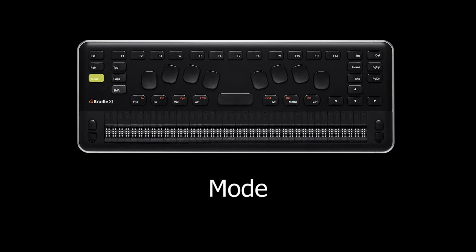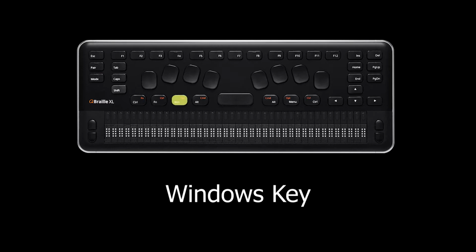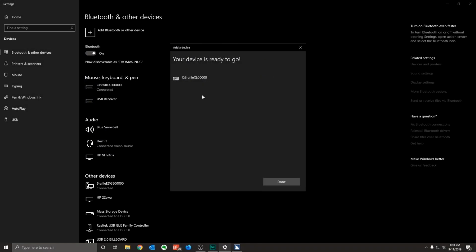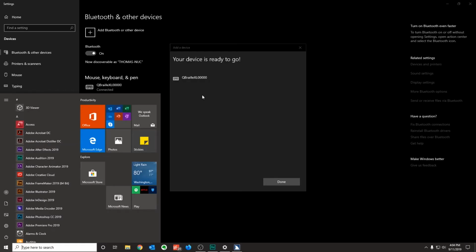To do this, I'll just hit the Mode button on the QBraille, and I'll get a Braille notification that hybrid mode has been turned on. I could test if hybrid mode is turned on by hitting the Windows key on my QBraille, and if the Start menu pops up, that means hybrid mode is working and my QBraille is ready to go. If you followed along and the QBraille is working, then feel free to stop the video.